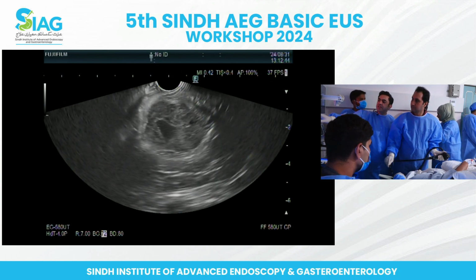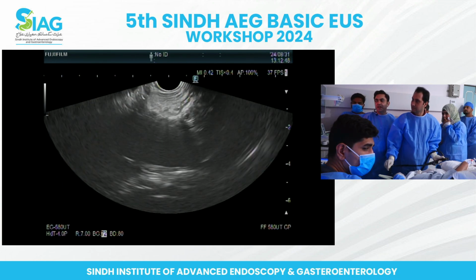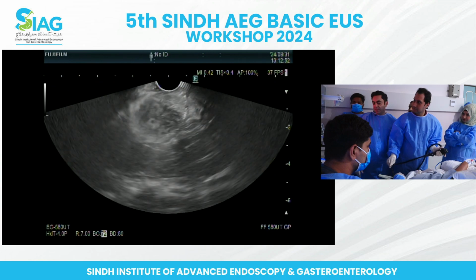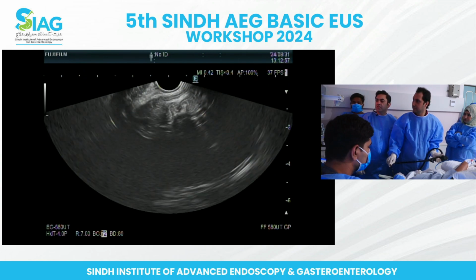And you can see there are multiple hypoechoic areas as well. That goes with it being a GIST. Just rotate it all the way. So it's close to the other organs. Yeah. So make sure we don't stick a needle in those.